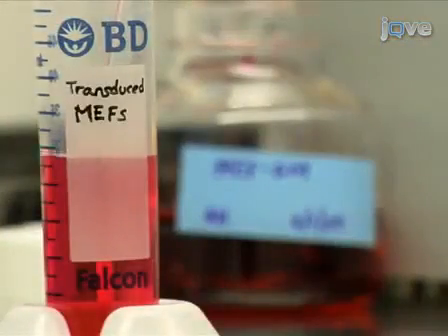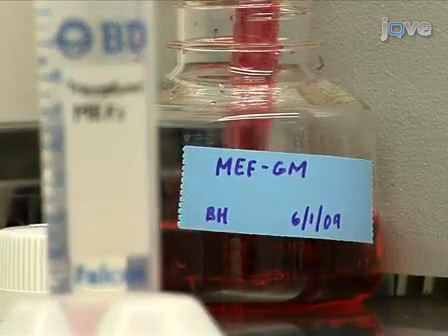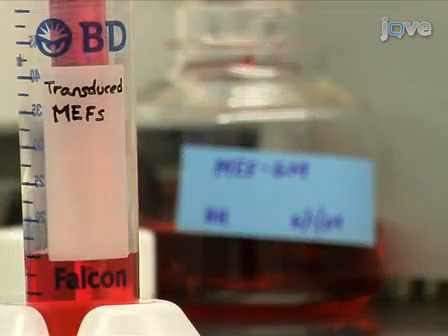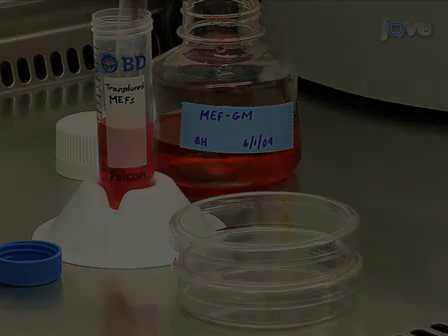Next, carefully aspirate the media off of the cell pellet and resuspend the cells in growth medium. Once suspended, seed the transduced MEFs at an appropriate concentration.